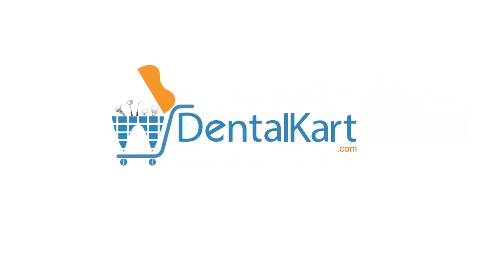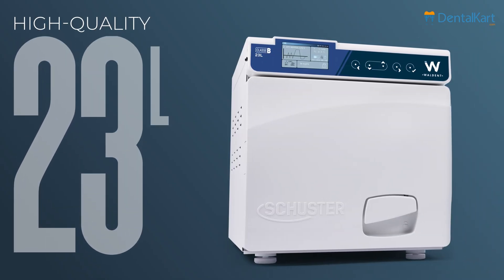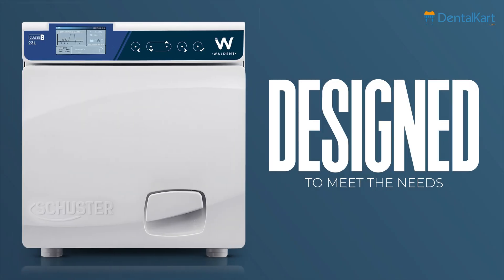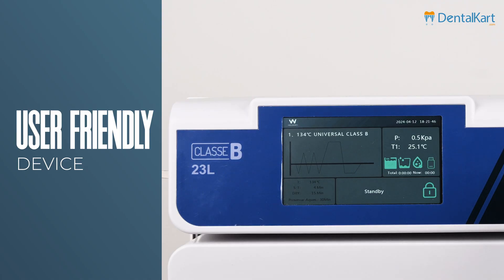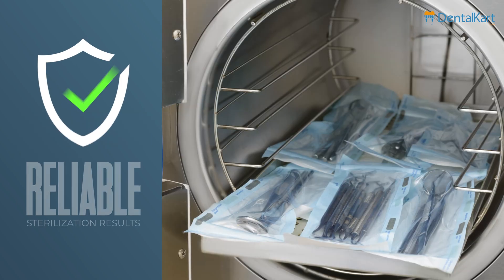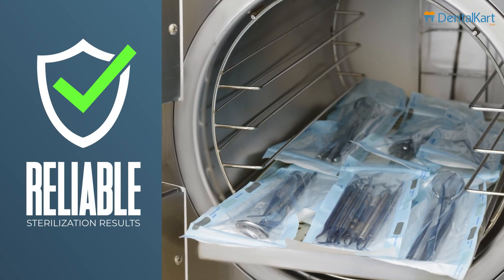Hello esteemed dentists, today we'll discuss the Walden Schuster Class B Autoclave, a high quality 23 liters steam sterilizer designed to meet the needs of clinics, hospitals and laboratories. As a user-friendly device, it ensures reliable sterilization results, making it an essential tool for your practice.